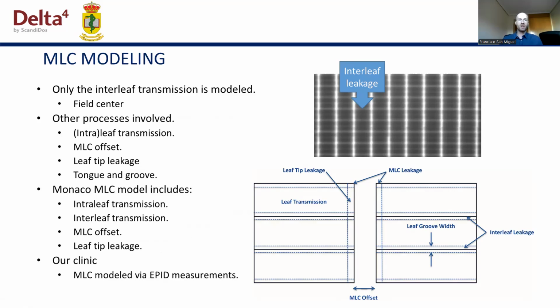Besides, since the treatment planning system has been thoroughly verified and validated through a large number of measurements, and a fine-tuning of the MLC behavior has been performed, the dose calculated by Monaco is considered our reference. In other words, if those discrepancies are observed, we generally regard the treatment planning system dose as the ground truth.